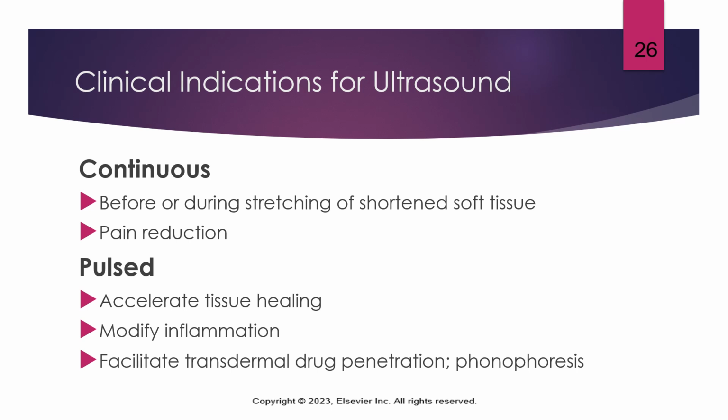So we talked about ischemia and how that causes pain. So increasing blood flow to certain areas can help to relax the tissues. If you have something like a trigger point, or any kind of adhesions, things like that, we can deliver blood, we can heat the tissues, we can reduce pain in those different forms.